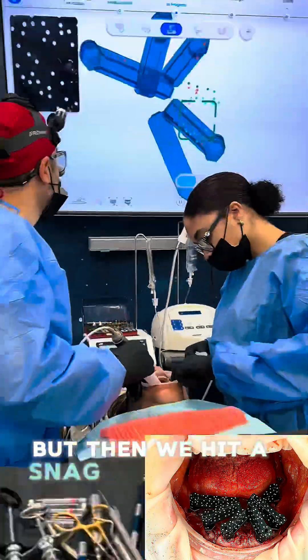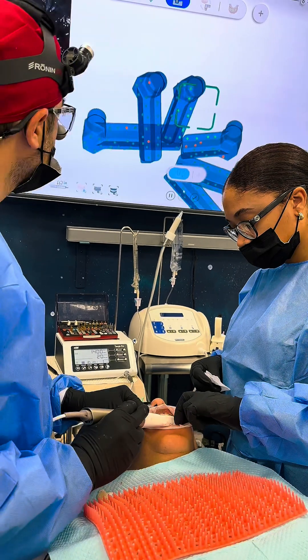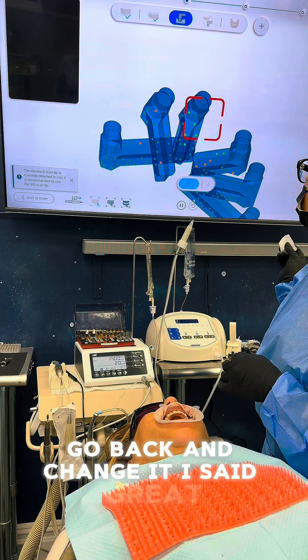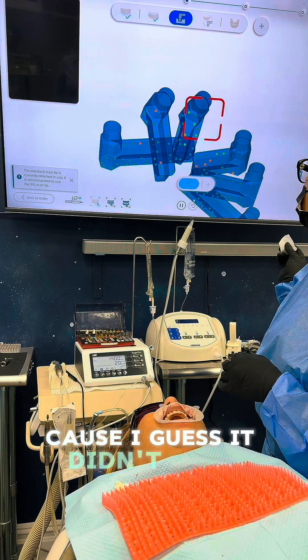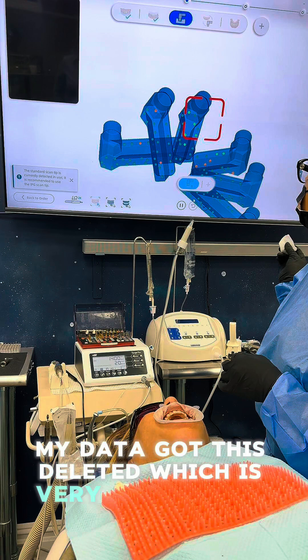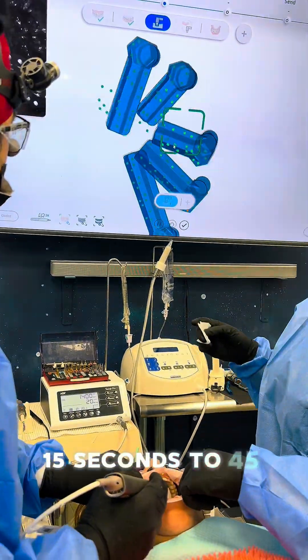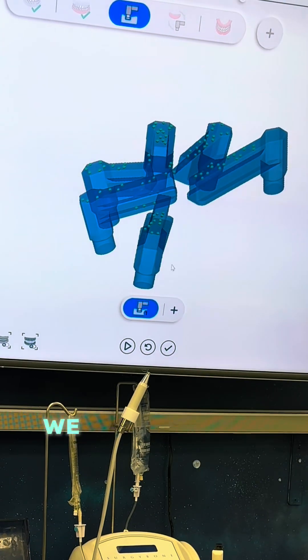Then we hit a snag. The software told me I created the order with only two implants and to go back and change it. No problem - I went back and changed the implants from two to six because it didn't save correctly. But then my data just got deleted, which was very frustrating. We went back and rescanned and they popped right back up - about 15 to 45 seconds to pick up everything needed.